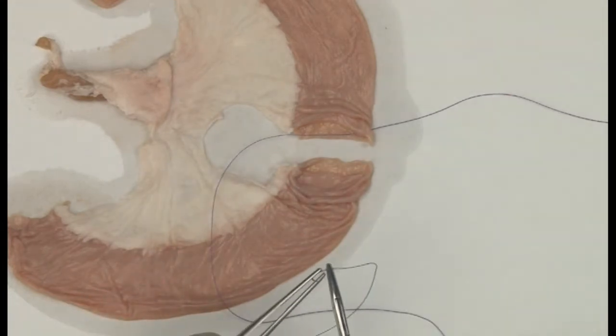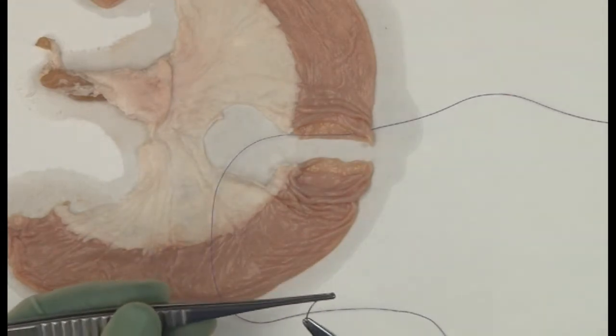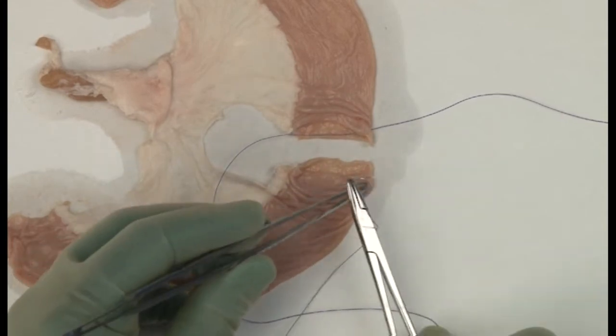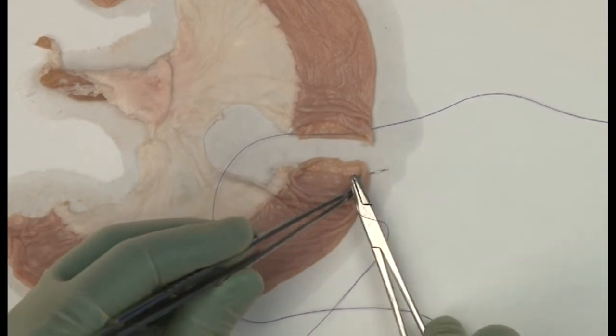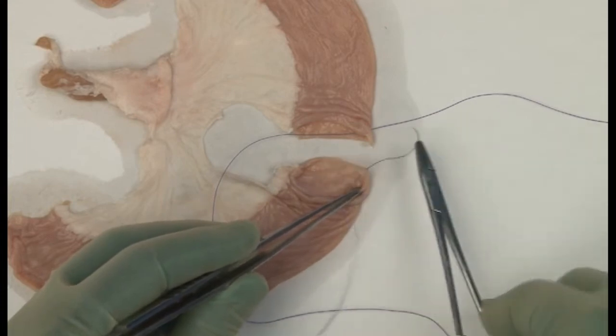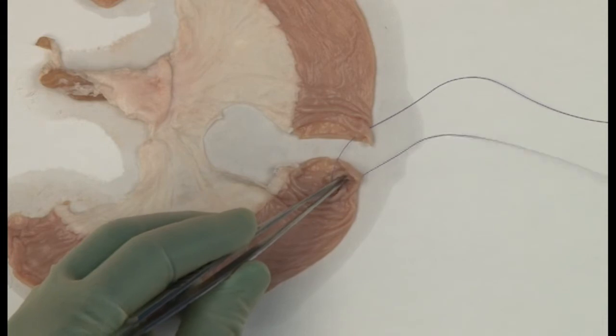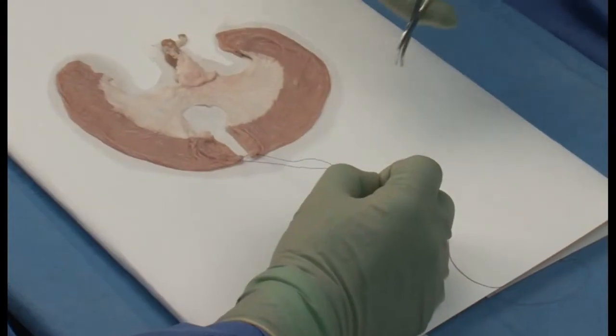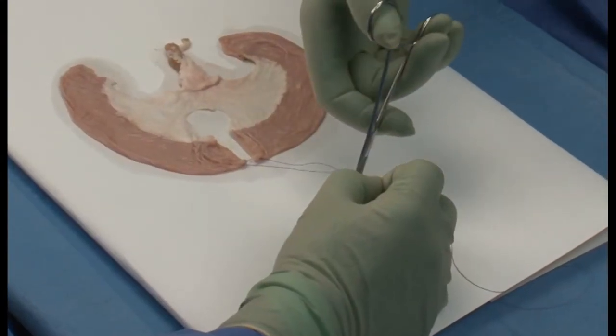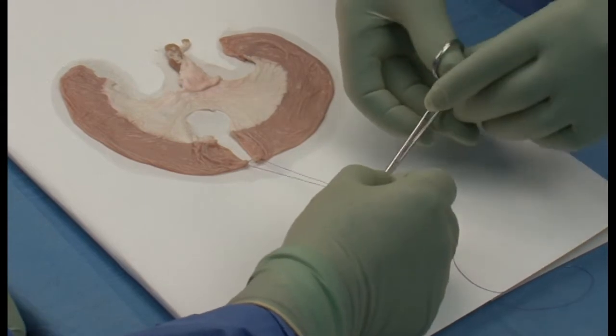We start the anastomosis at the anti-mesenteric border, inserting a suture in the anti-mesenteric angle of the bowel from outside to in, and then across to the other loop of bowel from inside to out. Place both ends of the suture in a hemostat, but leave them untied.